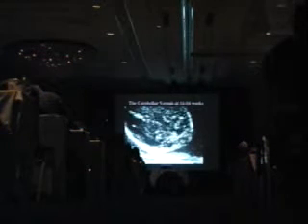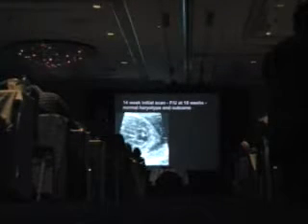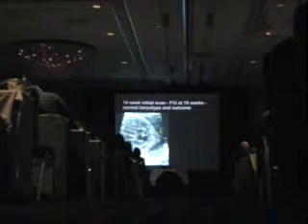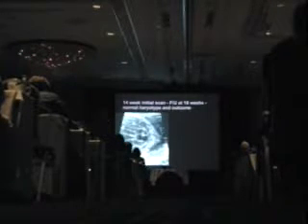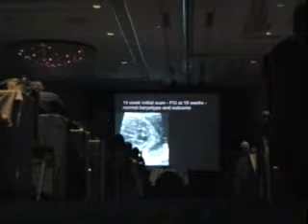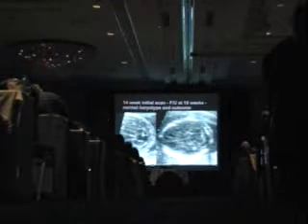Now beware of calling Dandy-Walker abnormalities too soon. Here is one that we saw at 14 weeks, and we called it Dandy-Walker abnormality at that time, even convinced the patient to have an amniocentesis. She came back at 18 weeks, and it was completely normal.